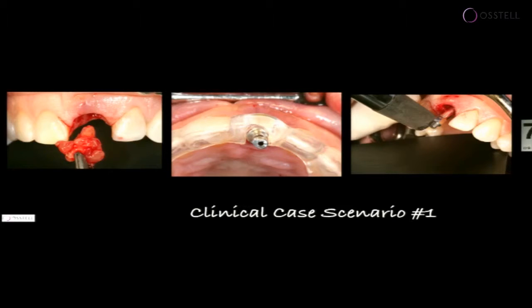Nonetheless, we want to look at the aggregate and look at the general stability of this, and it's not quite accurate to average these two values, but it is worthwhile knowing them. And if it was a very significant difference, you would take that into account. The other thing that we talked about when we were reviewing this case is you'd like to know some of the drilling conditions as to how this number was arrived at, or how this stability was arrived at.